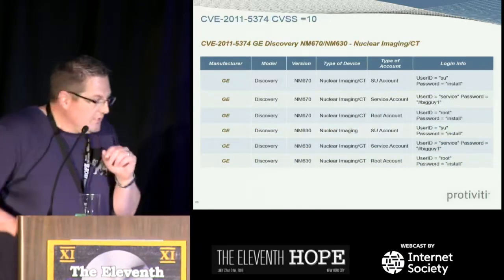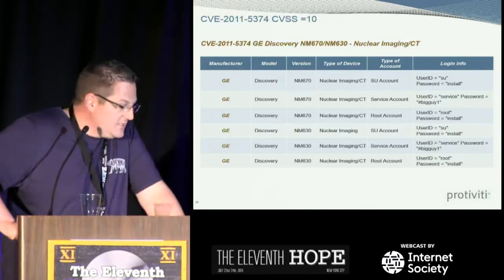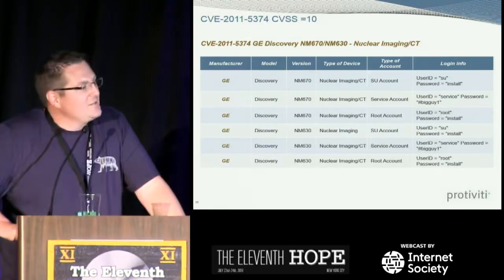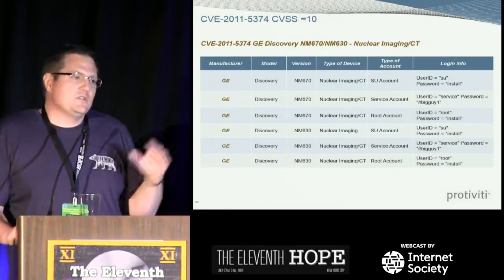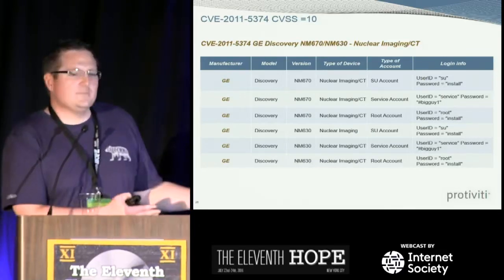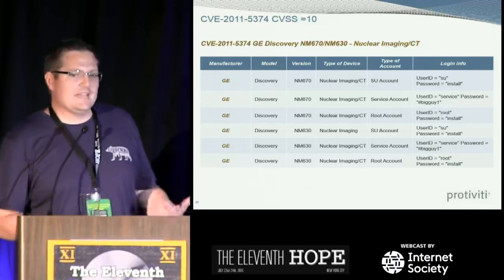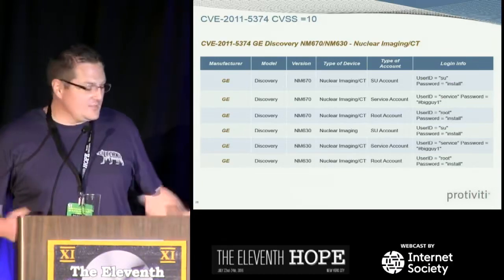So this is also a different version. You can see this one's from 2011, of nuclear imaging and CT scanners, and you have, you know, pound Big Guy 1. Those are also really awesome. And the thing that you see across this, when you look across all of them, is a certain password where you're like, hey, this development team must have quit this product and now started on this product, because Big Guy is coming from like 2000 all the way to 2016 across like 7 product lines, right?